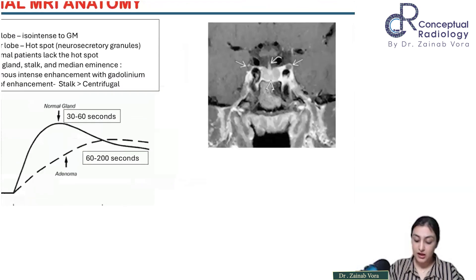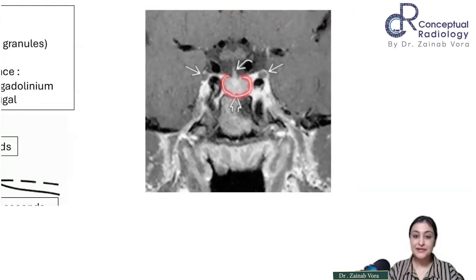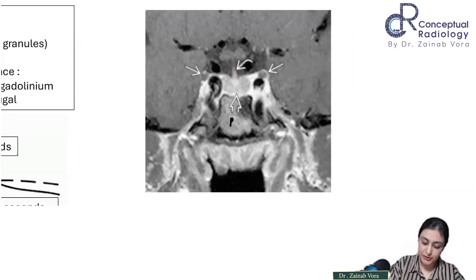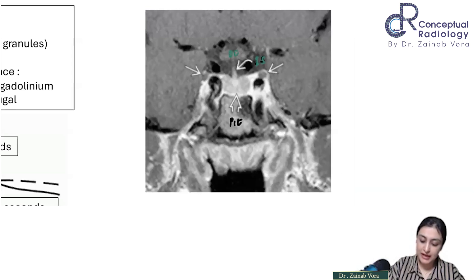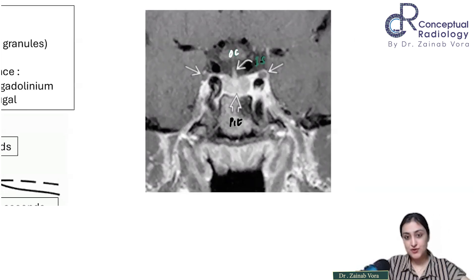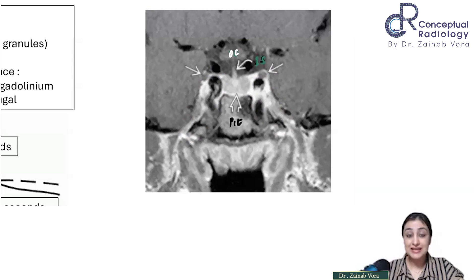Now anatomy on the corresponding coronal images. On these post-contrast images you can see the pituitary gland and the infundibular stalk. Also visible is the optic chiasma. On either side of the pituitary lie the paired cavernous sinuses. The anterior lobe is iso-intense to gray matter, and the posterior lobe is the T1 hotspot — importantly, about 20% of normal patients lack this hotspot, so its absence does not always indicate pathology.